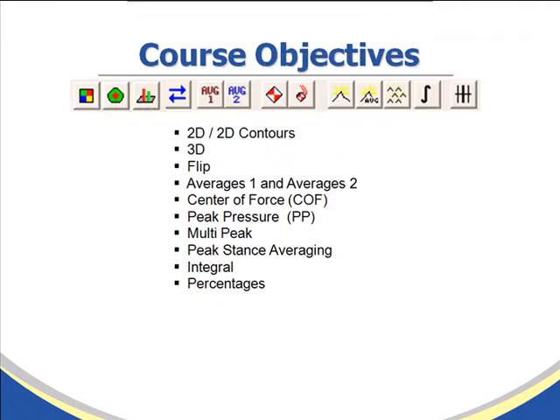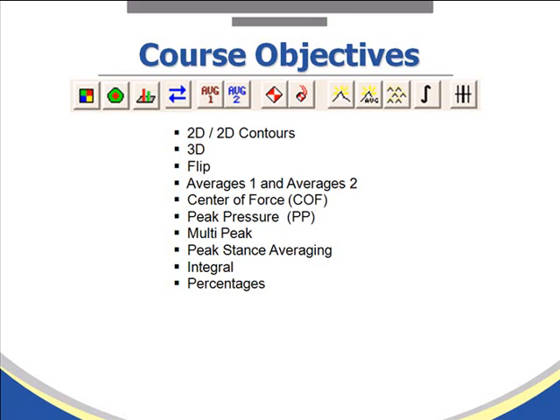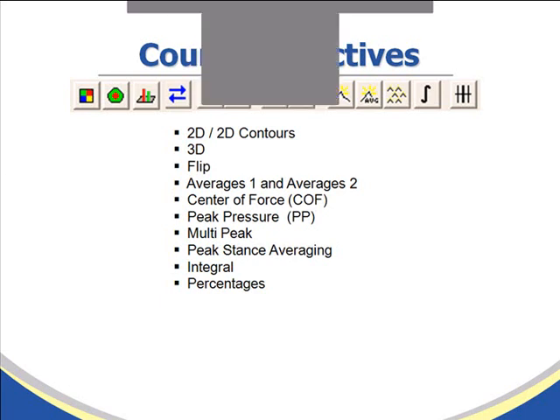Qualitative data analysis consists of the following icons: 2D and 2D contours, 3D, flip, averages 1 and averages 2, center of force and center of force trajectory, the peak pressure icon, the multi-peak icon, peak stance averaging, integral and percentages. So now we'll go into the software and review each one of these.